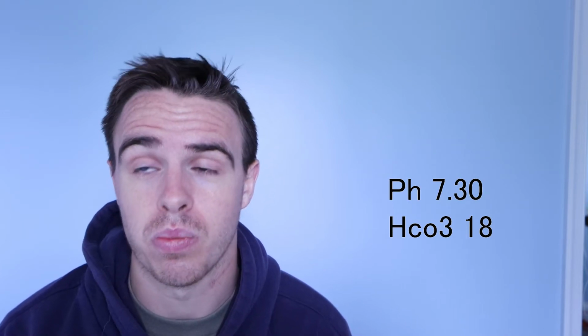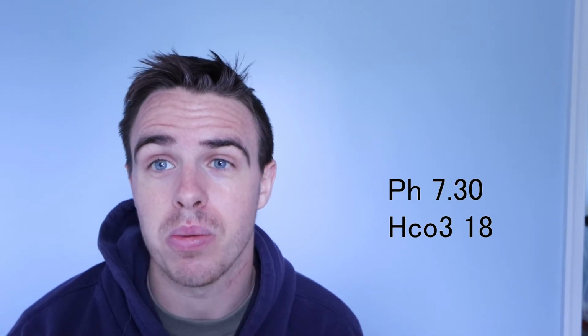Let's look at this one here. We can see that our bicarb is 18 and then our pH is 7.30. So we have less of that base, we have less bicarb. What's that going to do to our pH? It's going to bring it down.